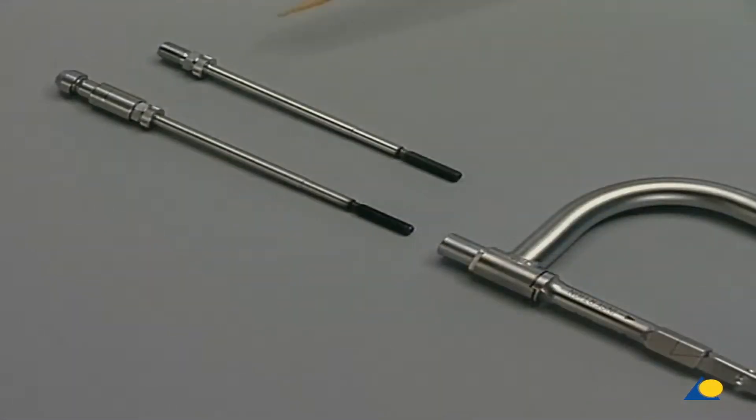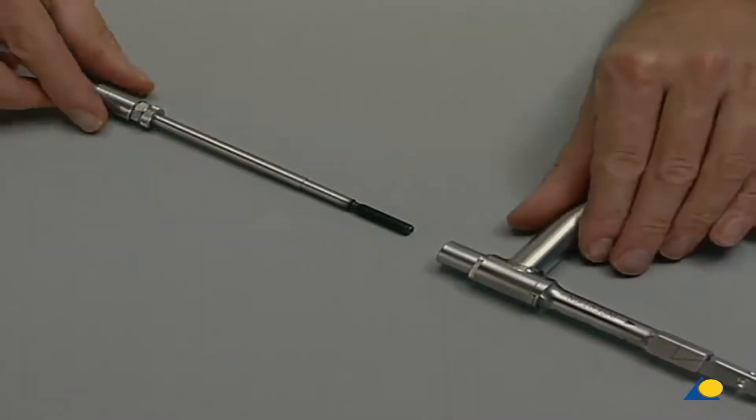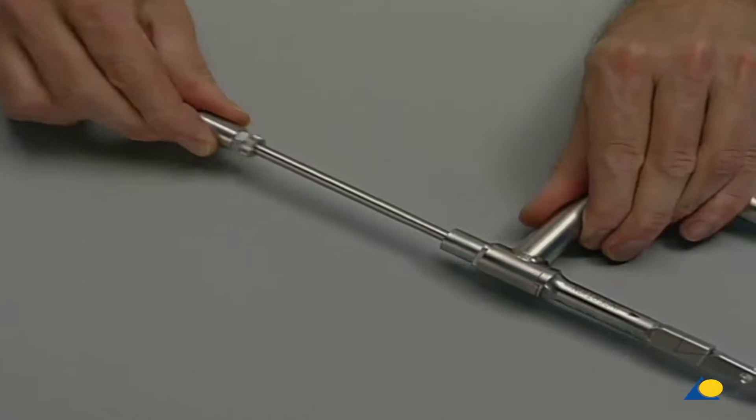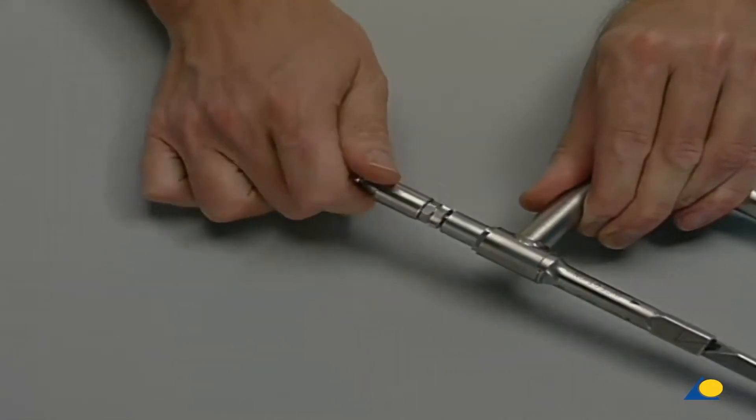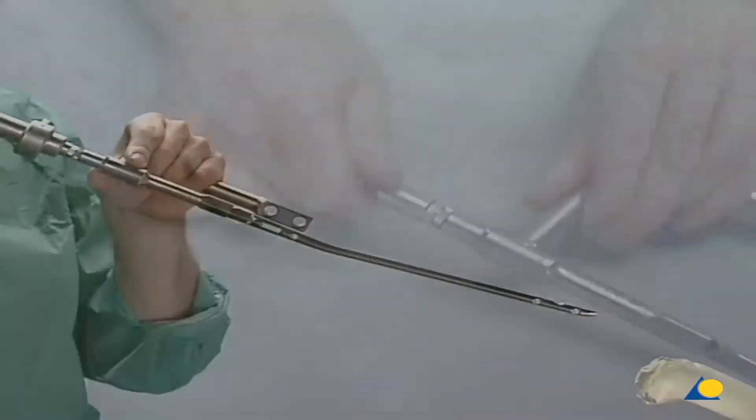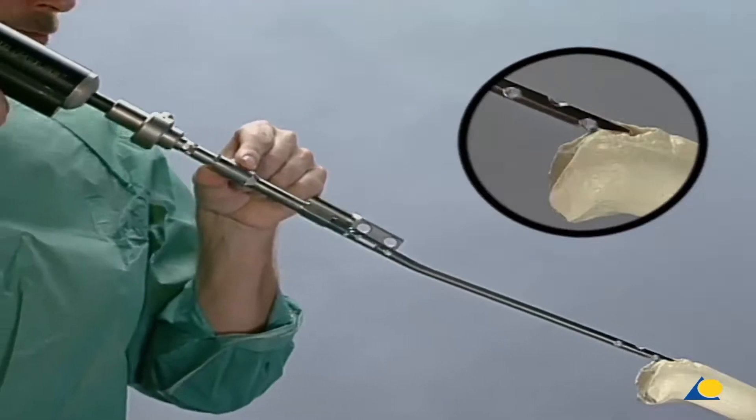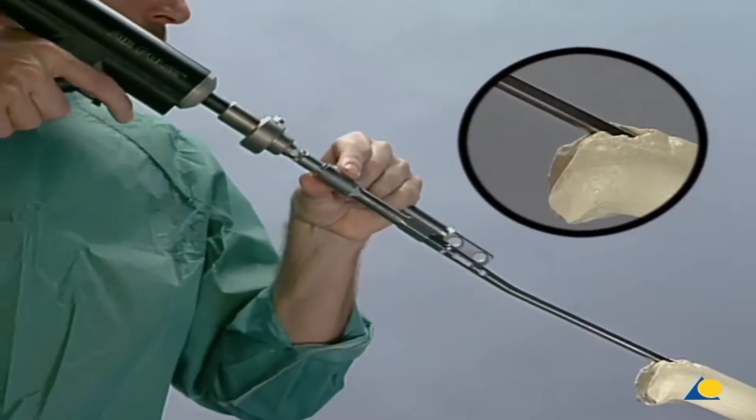The insertion handle is attached not with the usual connecting screw, but by mounting and fixing the special connecting screw, which can be connected to the air pulse. Then the UTN is slowly advanced into the medullary canal with the air pulse.